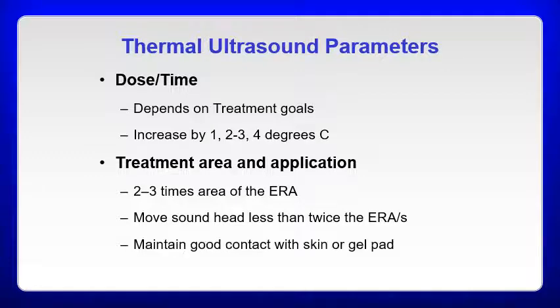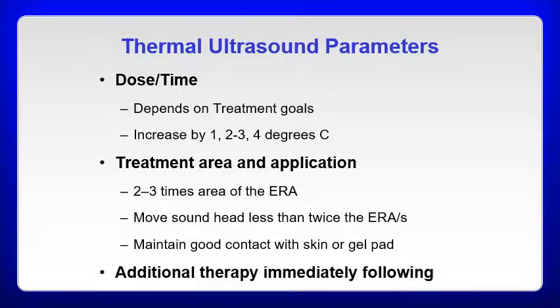Maintain good contact with the skin or the gel pad. So think of those things we talked about as far as energy transmission in the earlier chapters. So you want to make sure that you're maintaining good contact. You're not constantly lifting the sound head off of the patient. Every time you lift the sound head off of the patient or it comes out of contact with their body part region, you're losing that part of the treatment.